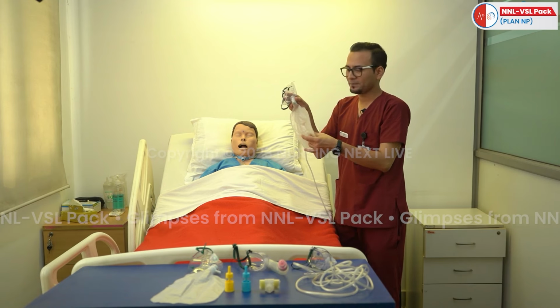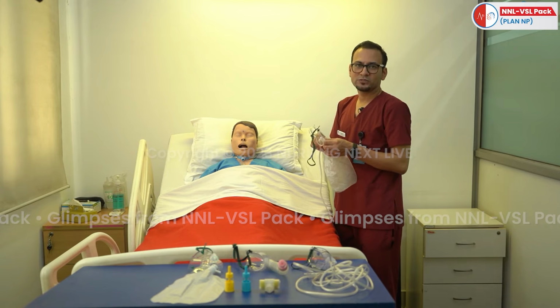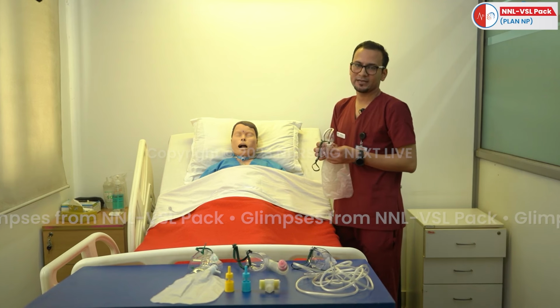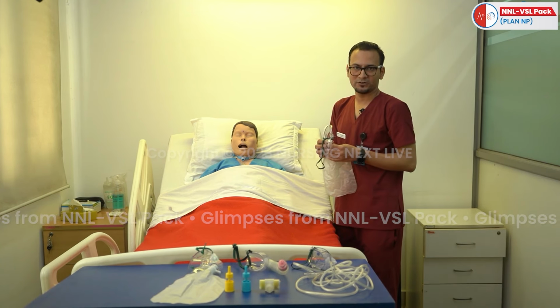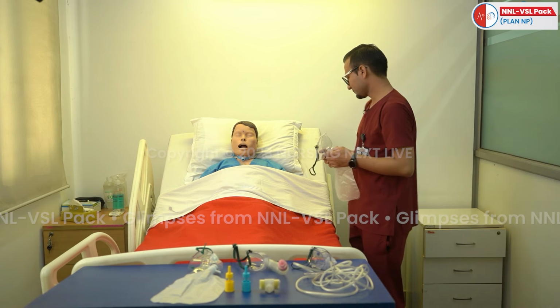and carbon dioxide. And the indication of this mask is, this mask we are widely using for the patient who is having carbon monoxide poisoning, cluster headache, and patient who is having a physical trauma. So this is all about the partial rebreather mask.